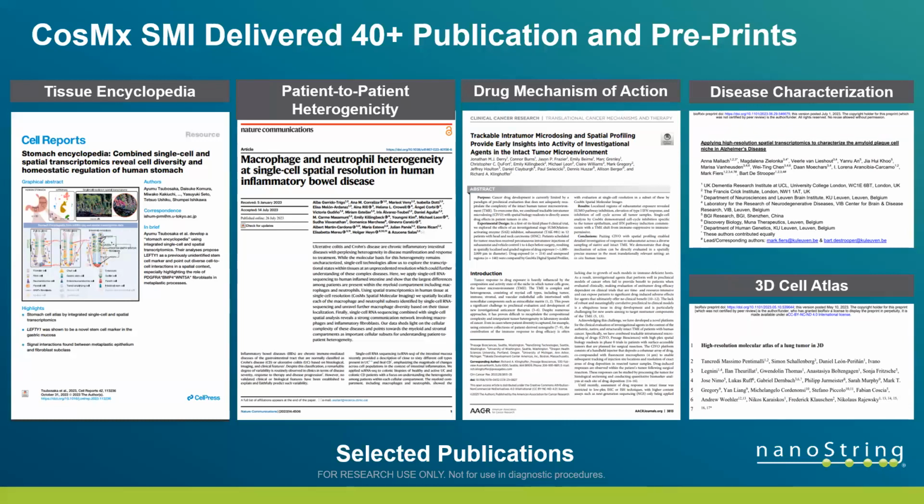With these systems that are coming out and being used locally, there are some interesting applications, perhaps running the assay and then doing a xylene application in between, and then being able to run the 1,000-plex following that. But the initial data sets that we have are being run on a serial tissue section. But we have demonstrated some proof of principle of being able to do just that, layering the 64 protein assay on the 1,000-plex panel as well.